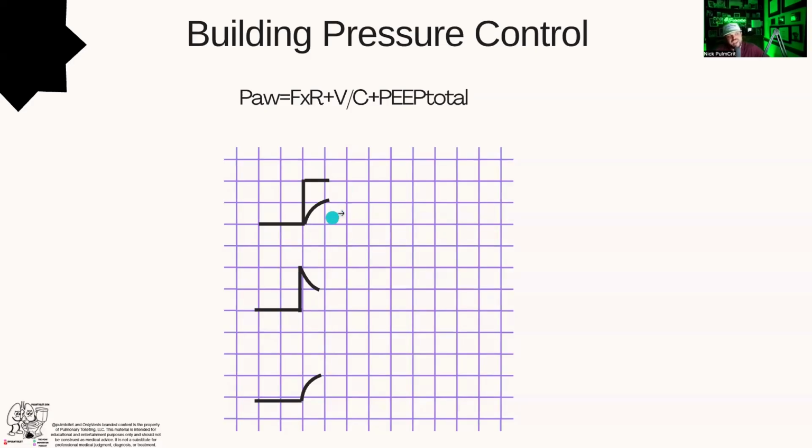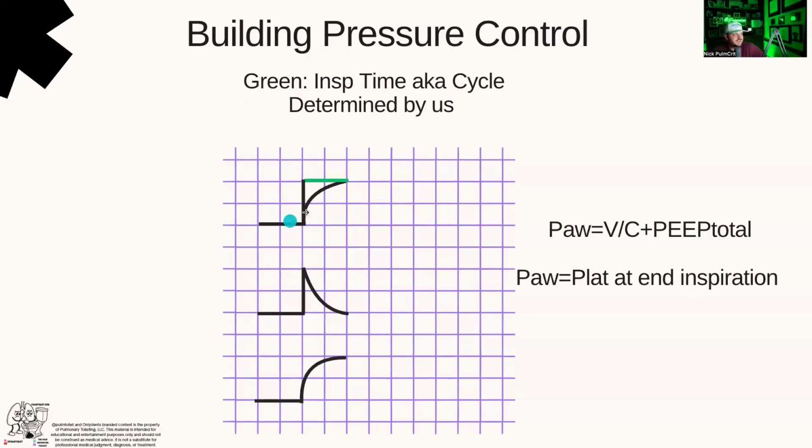So maybe you're halfway through the breath. You have this initial rise in flow. Then you start to decay towards the baseline as you fill the lung up, as you normally breathe, right? If you take a breath in now, the most flow you're going to get is right in the beginning because you have the highest delta pressure. As you get flow and volume, they start to exert a pressure, and that pressure differential shrinks, and then the flow goes down and down. Now, you can drop your diaphragm more and get more flow, but that's not because of the strict mechanical properties of the lung, right? You're including your diaphragm in that. And that's the basis for PSILI, patient self-induced lung injury.